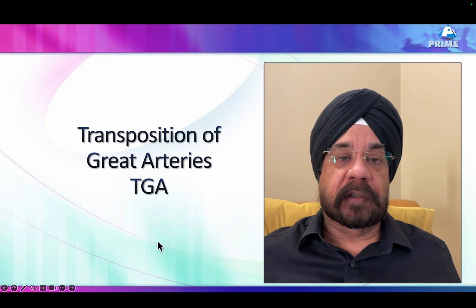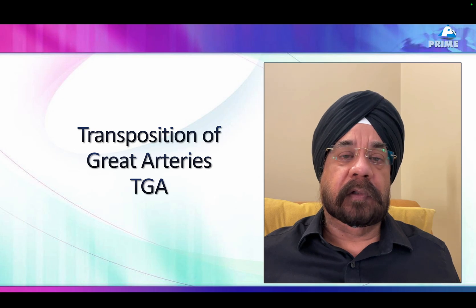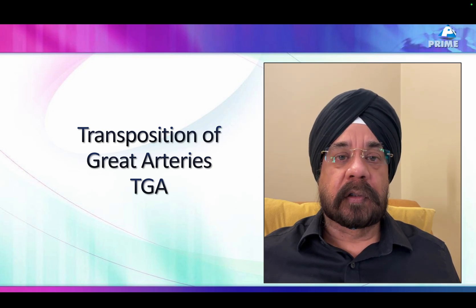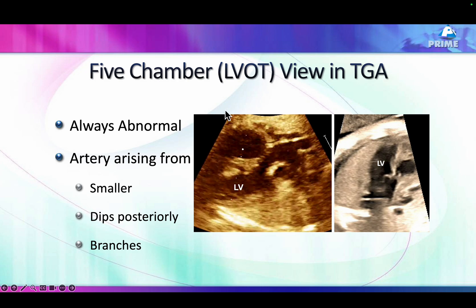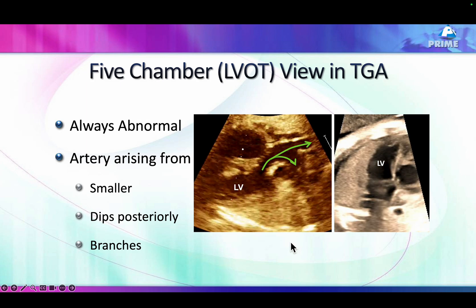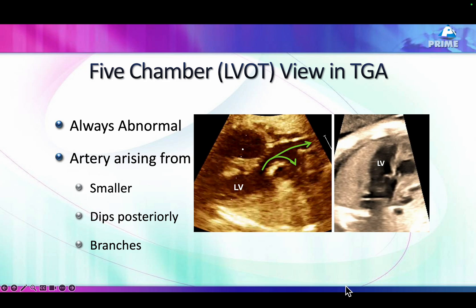Next in the area is transposition of great arteries — very easy to diagnose on a neonatal echo or an adult echo, but difficult in the fetus due to the issue of resolution. Once you see a four-chamber view, you may be lucky to see the artery coming from the LV, which is smaller, and you see it is branching into two. The artery coming from the left ventricle is branching, which means this is the pulmonary artery.